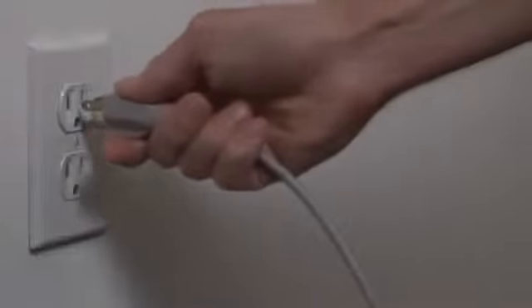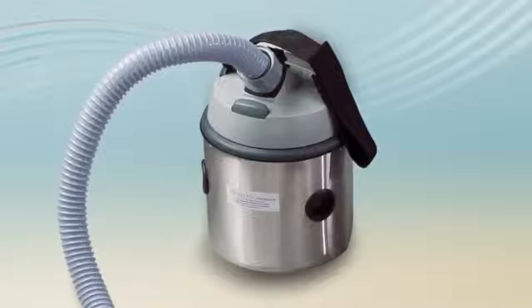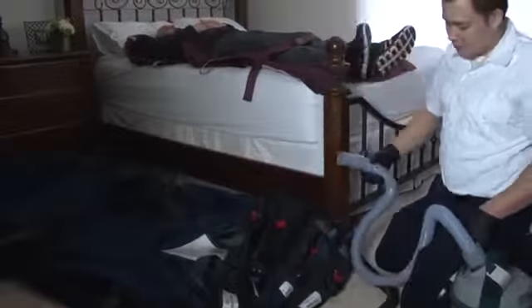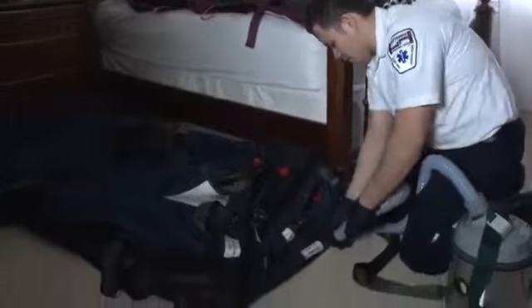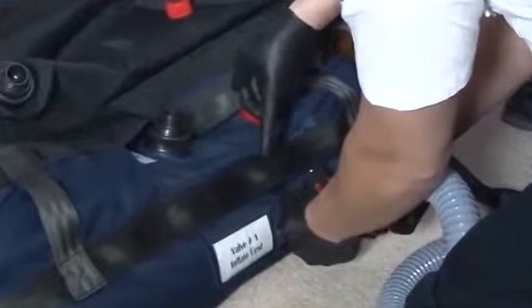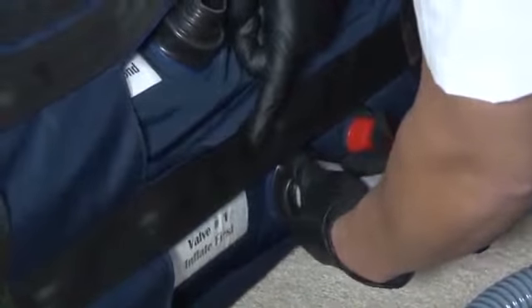Plug the air supply power cord into the nearest available electrical outlet and press the power button on the air supply unit. Begin inflating the device by placing the hose end over the black valves, starting with the chamber closest to the ground, labeled valve number 1. It is important that each chamber is inflated in sequence for safety, starting with the chamber labeled valve number 1, which is closest to the floor. If chambers are inflated out of order, the Evacuation HoverJack 2 can become unstable.